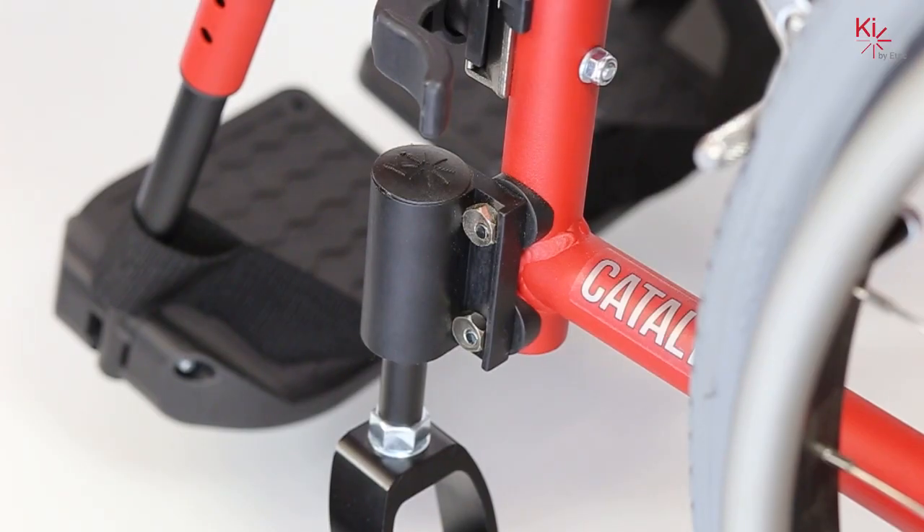In this video we are going to explain how to square the casters on a catalyst with a standard caster housing. Please note our catalyst does not have transit. The tools required to make this adjustment will be a five millimeter Allen key.